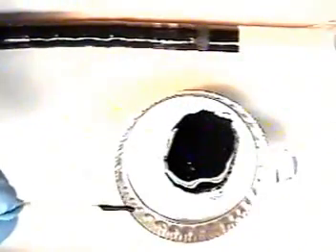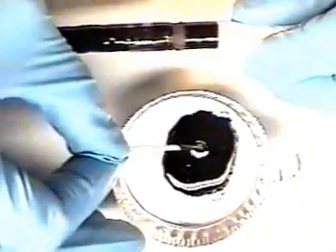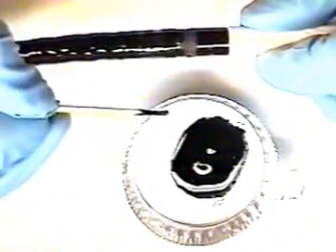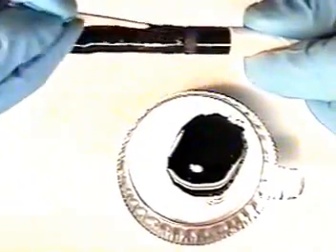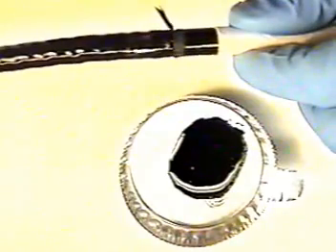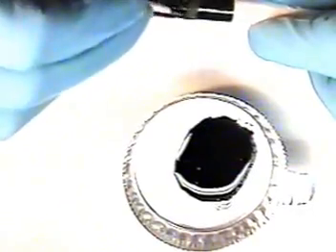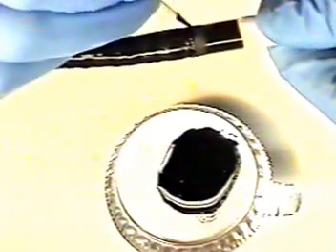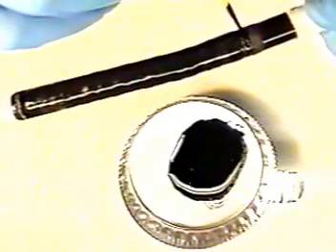We will now apply glue to our bending rubber sheath. First step is to take small amounts of our bending rubber sheath epoxy and fill in the gap first, initially between the insertion tube and the bending rubber. Fill in this gap with your epoxy. Turn the endoscope over if necessary in order to fill in the entire diameter with epoxy.